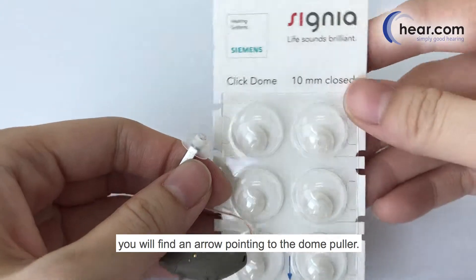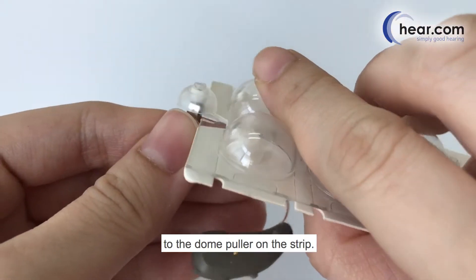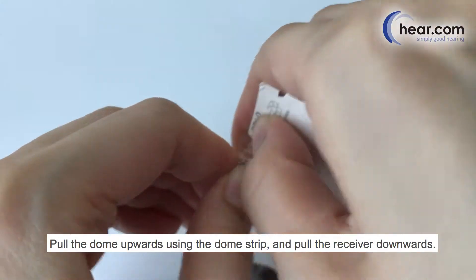You will find the arrow pointing to the dome puller. Take the hearing aid receiver and fit the dome from the receiver to the dome puller on the strip. Pull the dome upwards using the dome strip and pull the receiver downwards.